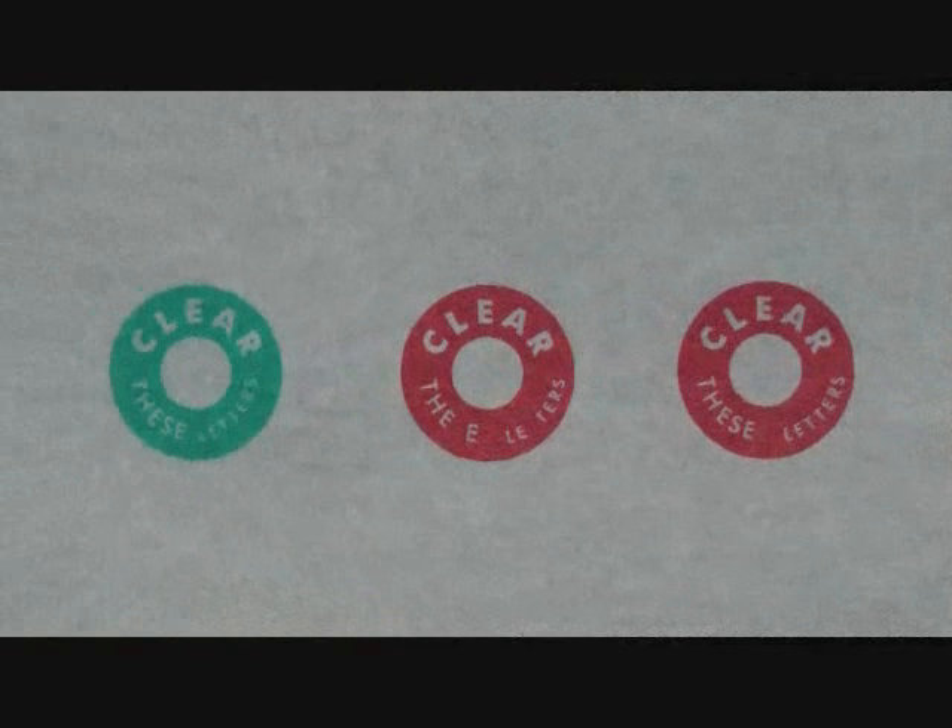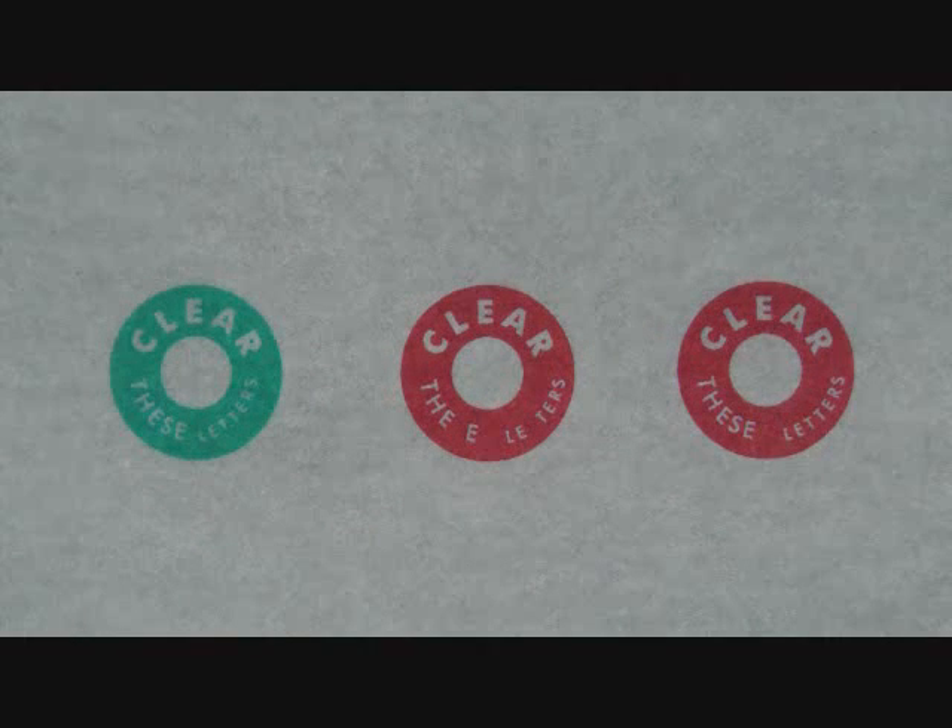You do not want to see two red and one green. If you see this, it means your brain is turning off the input from your left eye. This is called suppression.